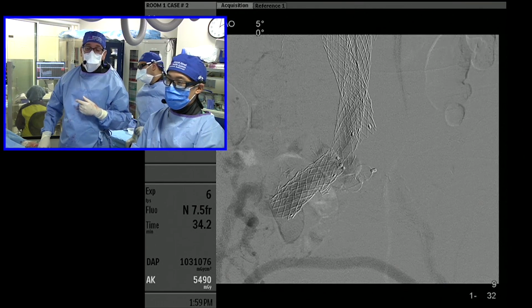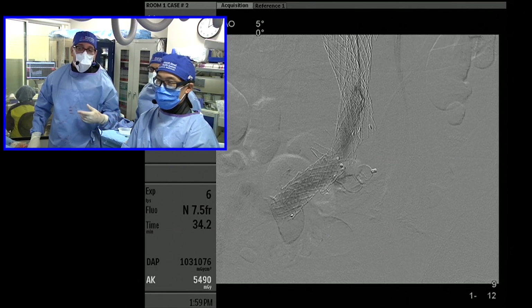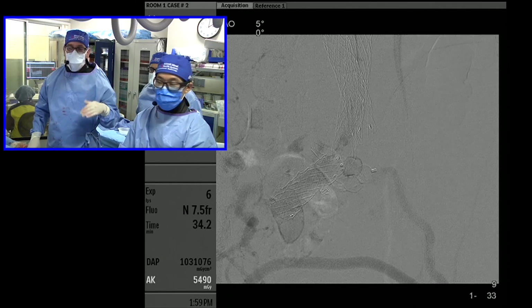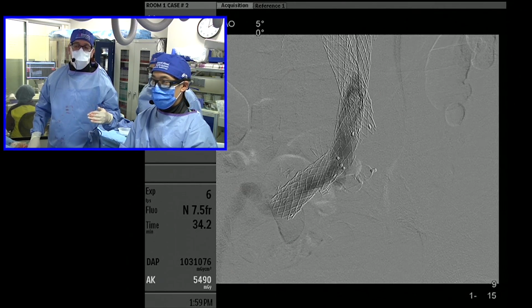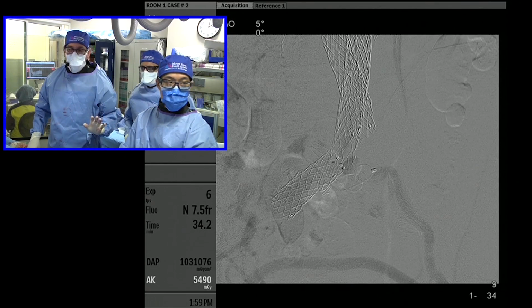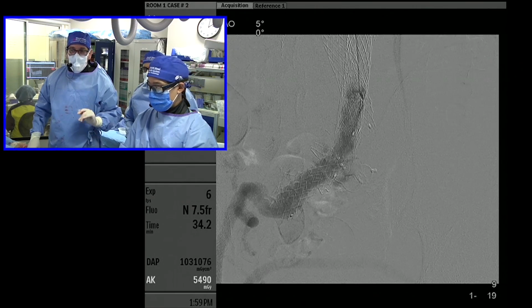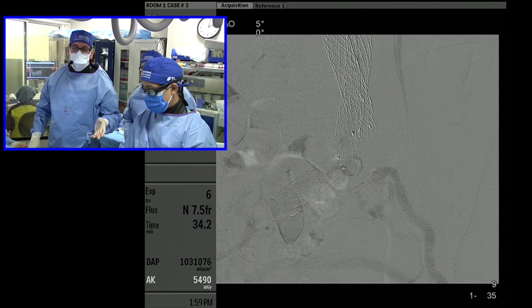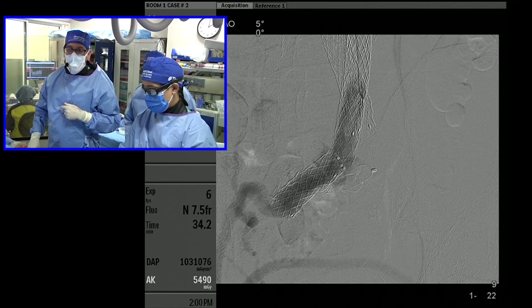We honestly said that this patient really might best be served with an open repair and an explant. And I know that we're all sort of endo first and everything, but honestly, with what we're talking about here, I'm not sure that we haven't reached the point of passing clinical equipoise. So I thought it was a good idea to perhaps stop because this was a little bit more complicated than we were anticipating.